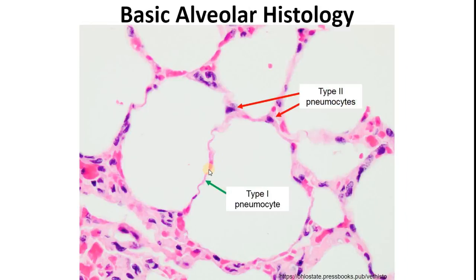Alveolar histology plays an important role in facilitating oxygen and carbon dioxide exchange between alveolar spaces and the blood. The alveolar wall, also called alveolar septum — or septa for plural — is very thin, as we can see here. It is composed of a single layer of alveolar epithelium known as pneumocytes, predominantly type 1 pneumocytes with fewer type 2 pneumocytes, which is immediately followed by a very small blood capillary lined by a single thin layer of flattened endothelial cells, as we can see here.